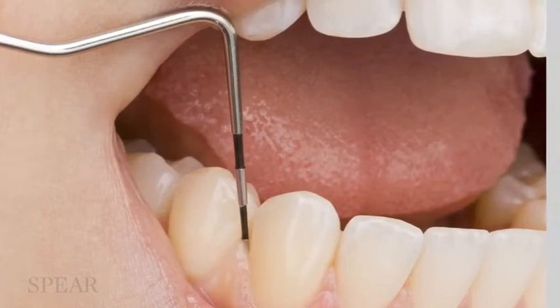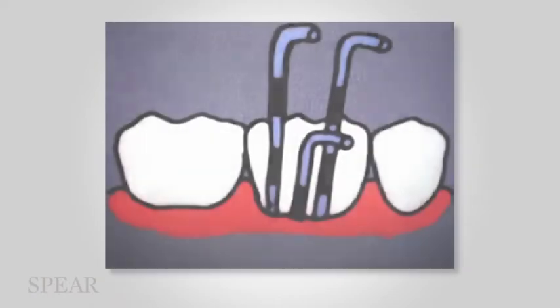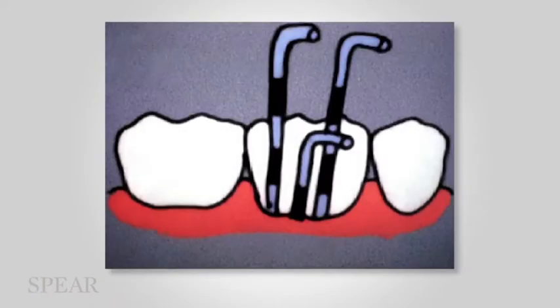Also, probing around the tooth is important. Specific patterns of probing are important to keep in mind, because when you have the type of probing in which you have a 3, and then suddenly a 7 or something, a narrow, deep probing is oftentimes associated with a crack or a fracture of the root or a split root, although it could sometimes be associated with a draining sinus tract. So we're going to talk about a sulcular sinus tract. We're going to talk about how to decipher the two and some of the other tests that come in handy when that's all the information you have.